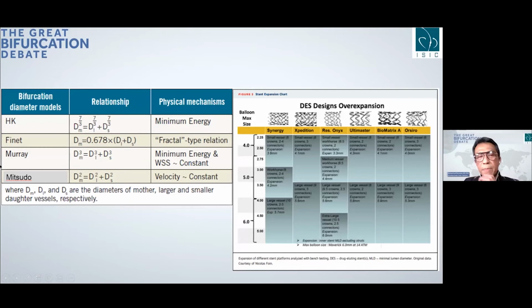You have to remember that, as Dr. Murasato mentioned yesterday, and Professor Guran also mentioned regarding trifurcation, 0.577. But if you neglect the ramus, then you can calculate the diameter of the left main as 5.4 millimeters.